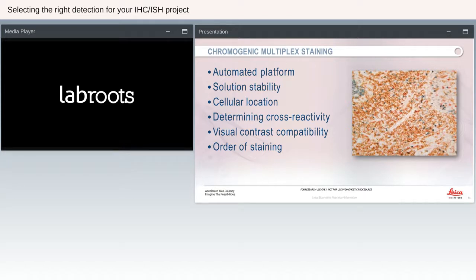So I had to keep that in mind as well. And then order of staining, we kind of discussed that already, where we decided to put on the CD marker, the very ubiquitous brown, first, because it held up better through subsequent rounds of staining. I believe then the red went on, and then we had the blue-green in the end.